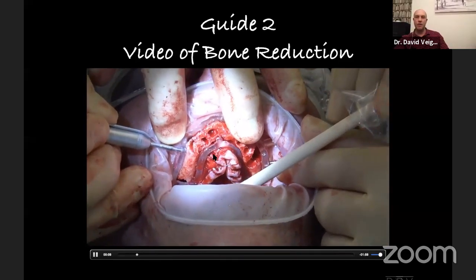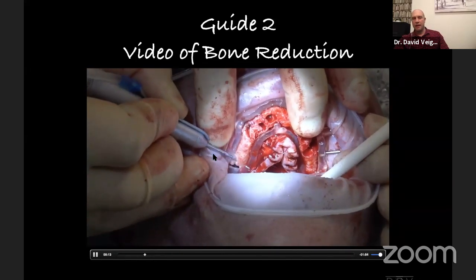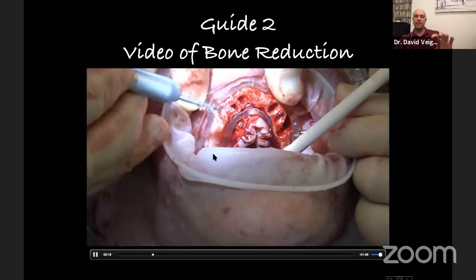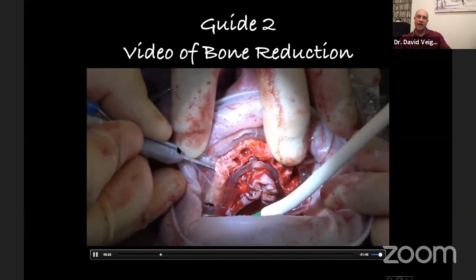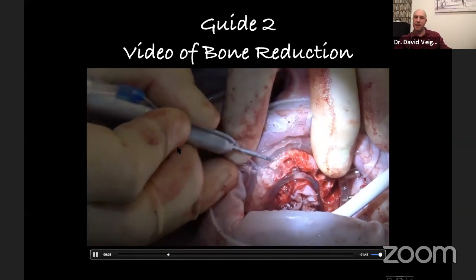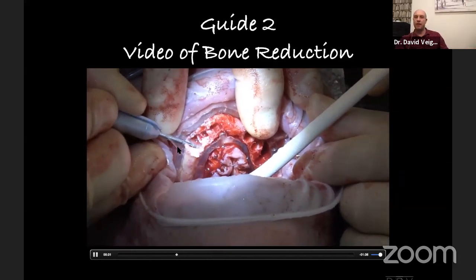Now, I like to use a number 7 carbide. The reason why I like to use it is it's quite efficient, and I can run the non-cutting edgeless shank on the surgical guide. You can see I just got the shank of the bur on the non-cutting bit right on the guide, so I can make a really nice level cut across the alveolus.